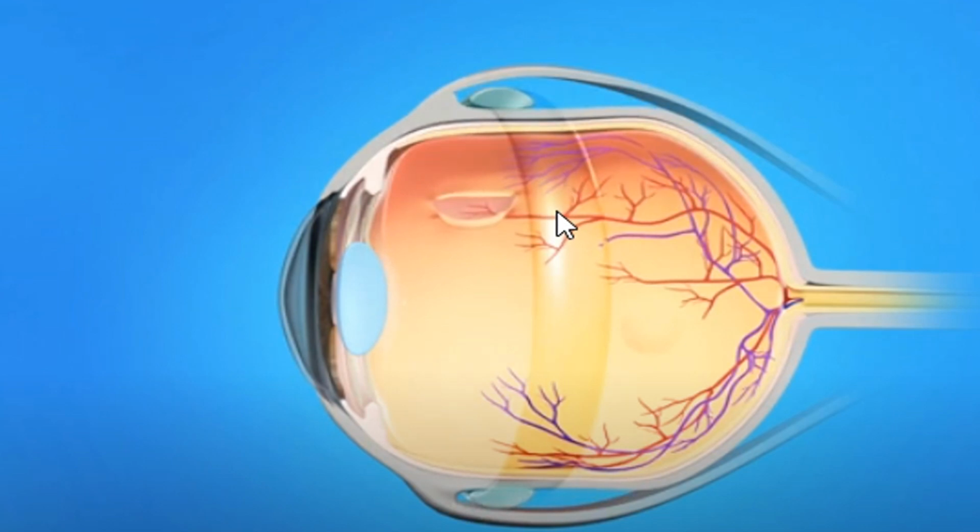Okay, so this is the scleral buckle I'm telling you about, and this is not the typical. Not every scleral buckle should be like this. This is the circumferential type, and I told you there is a segmental, just a segment which may be radial or whatever. So all of them have the same idea that we are pushing from the side of the choroid from outside after elevating the recti. Can you see this is the muscle, the extraocular muscle? We are relieving the muscle with a hook before the buckle, or you are exerting a limitation on the extraocular muscle. You will end your patient with squint.